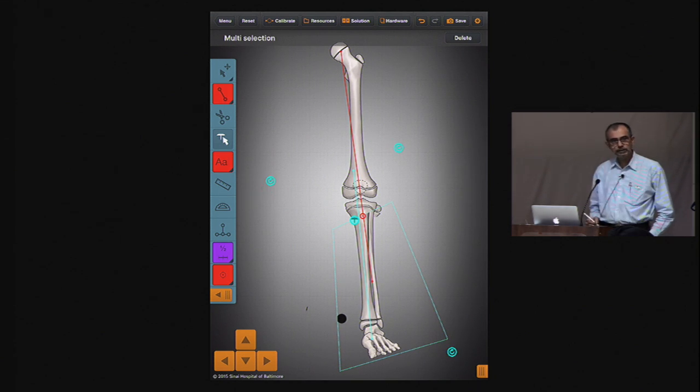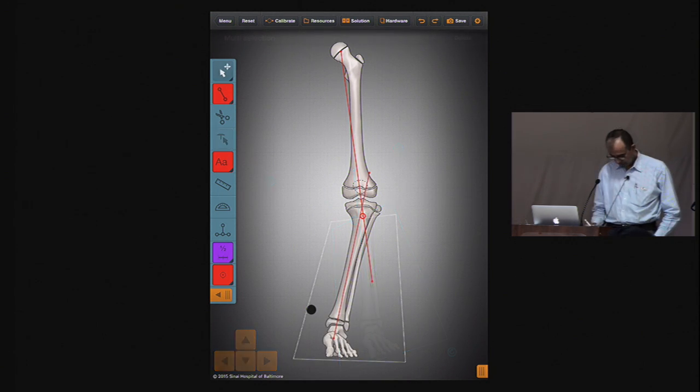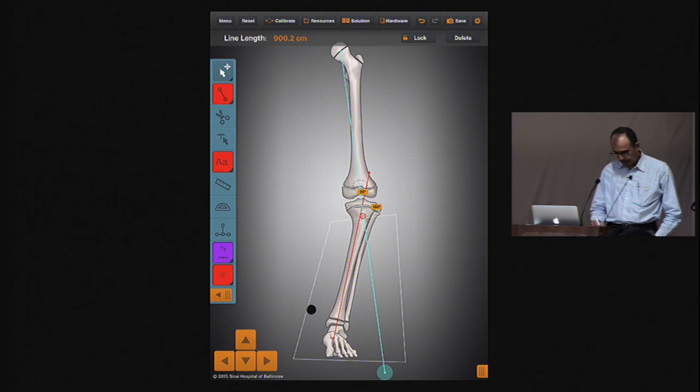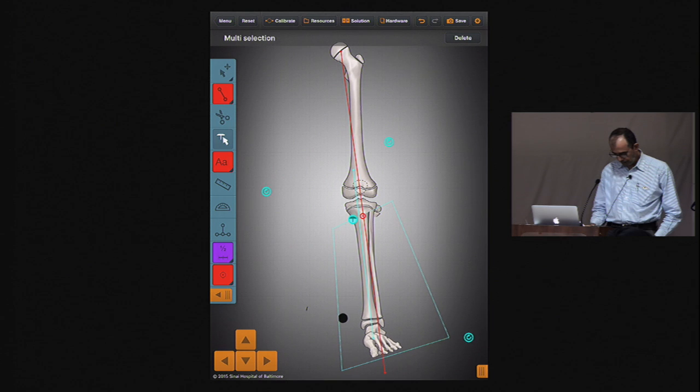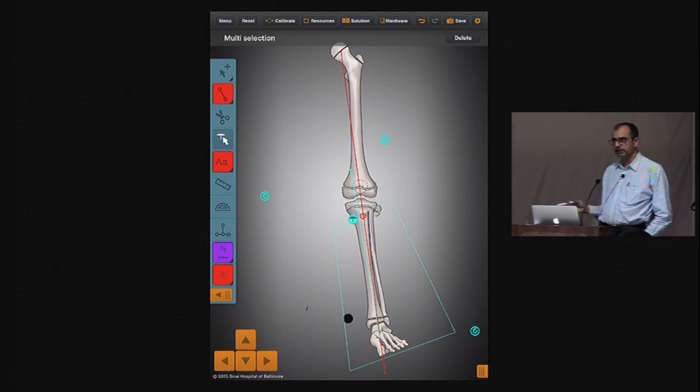and your bone looks well aligned, but what has happened to the axis? It is translated, right. I will extend this further so you can get the ankle actually onto that axis, and we are doing a closing wedge. So now my axis is parallel. You will say, what is the problem? Just do it a little more and your ankle will come on that axis, which is correct.